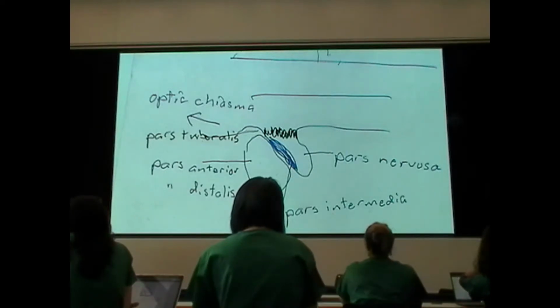It's quite amazing. I mean, it's brilliantly lit like neon. And okay, you know that the cell makes that hormone. And you can do that with any given hormone and identify specific cell types.